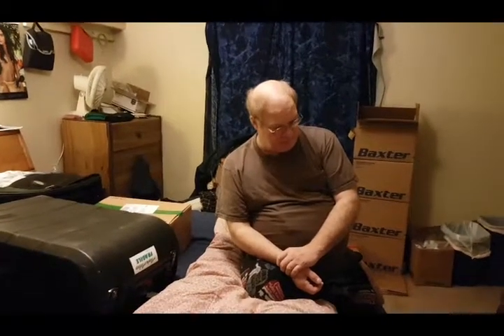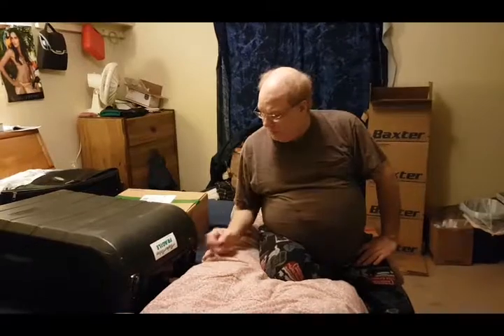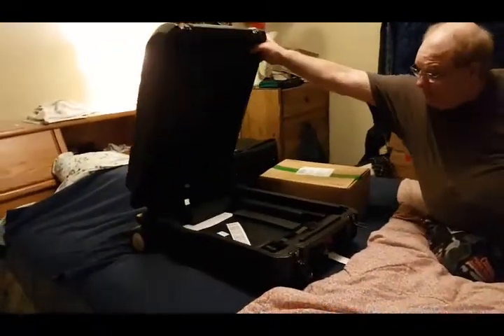Something we almost forgot to include in this video is, how do you travel while you're on peritoneal dialysis? Well, we have the answer for that too. So, every month I have to travel from a town in southeast Alaska called Wrangell to the capital city in southeast Alaska of Juneau. I have to put my machine in the case here. You can open it up and show them if you want. Yeah, I can. The machine kind of fits in there all nice and snug.